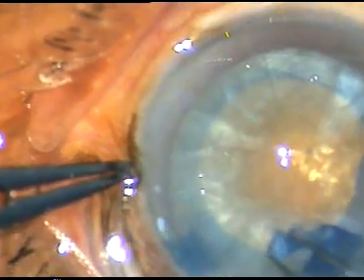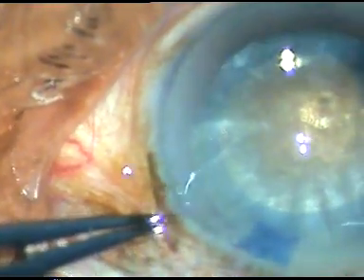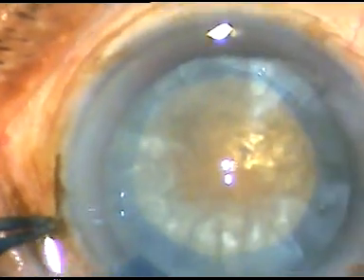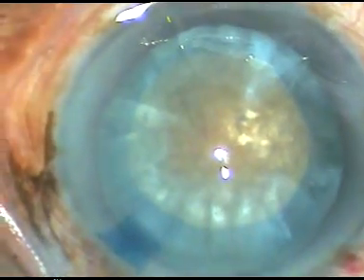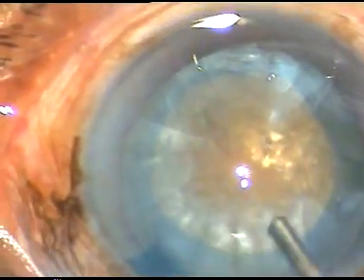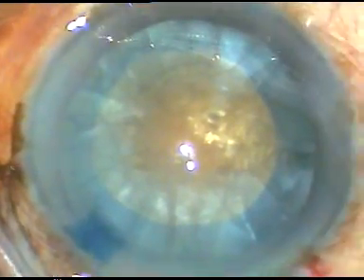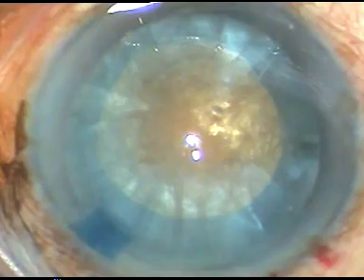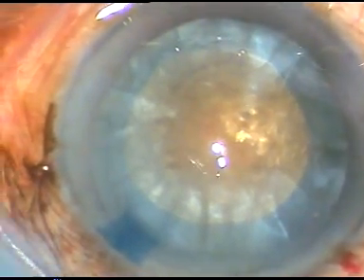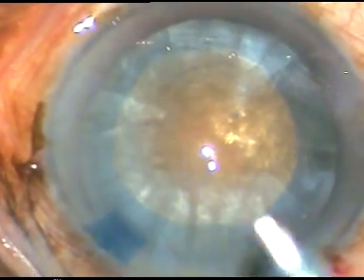In this case the capsular rhexis didn't become circular, but it is an acceptable continuous curvilinear capsular rhexis, and there is a hard cataract. You can see this brown tinge, and we can see this is cataracta brunescens.